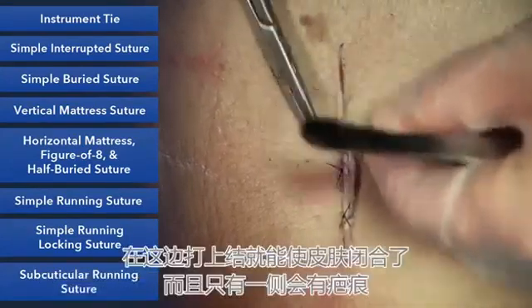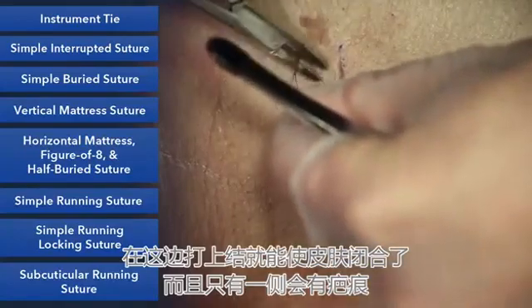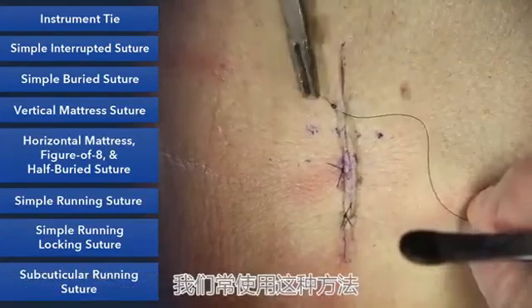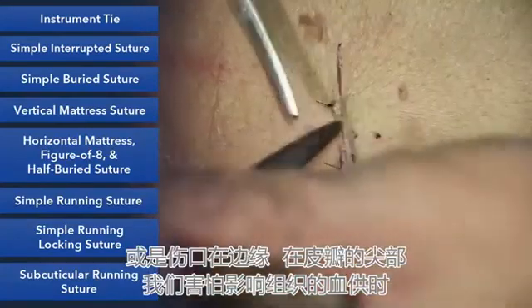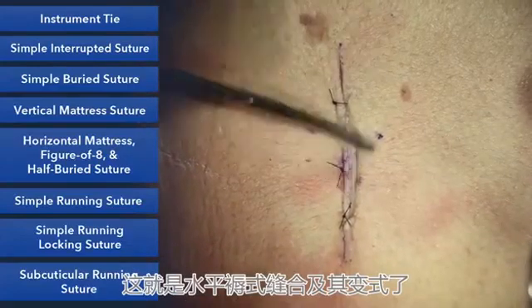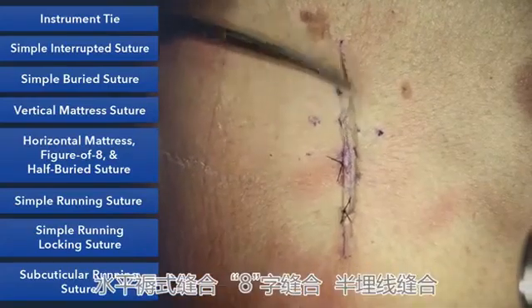And when you tie this here, it'll secure the skin, and you only have suture marks on one side. You'll see we'll do this at times when we have a hair-bearing area and a non-hair-bearing area, and we want to hide the suture marks. Or if it's a very end or tip of a flap, and we're afraid that putting sutures in the tip is going to interrupt the blood supply. So our three variants of a horizontal: the straight horizontal mattress, the figure of 8, and the half-buried horizontal mattress.